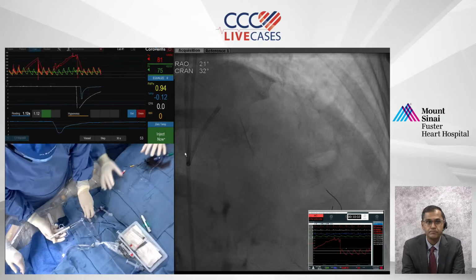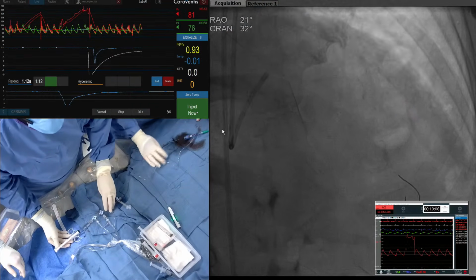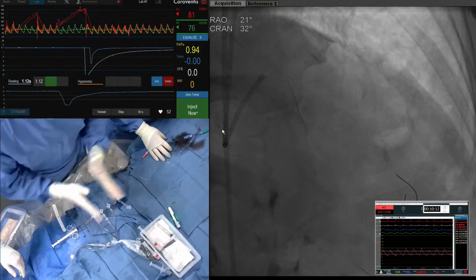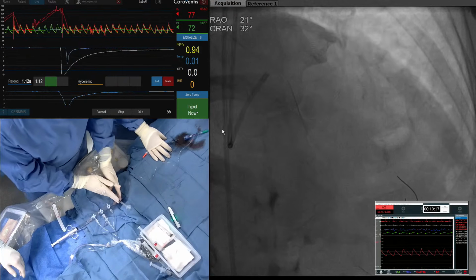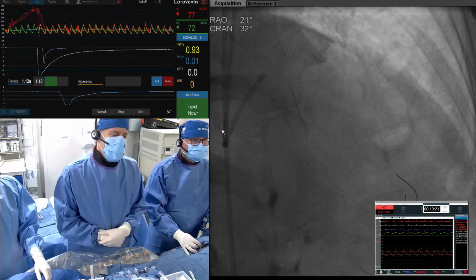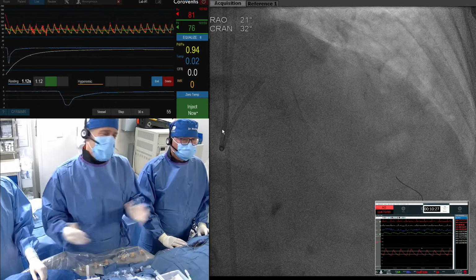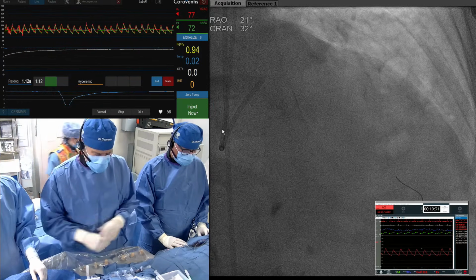Great. We're going to focus on this part, which is very important for the audience, which is getting the flow baseline. So Sumit, what we've done, we are now going to measure myocardial resistance, and there are two ways to do this. One is through a bolus saline injection, which is by and large what most of the country and the world is doing. But there is another way: the absolute microvascular resistance through continuous thermodilution, which is actually infused saline. We haven't really adopted that here, Sumit. I don't know if you have.